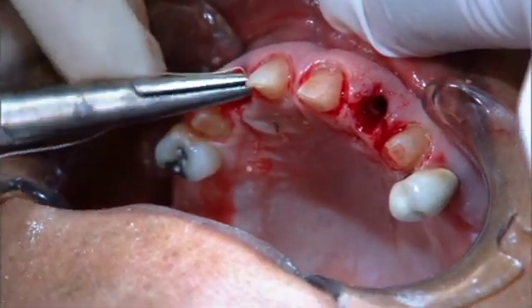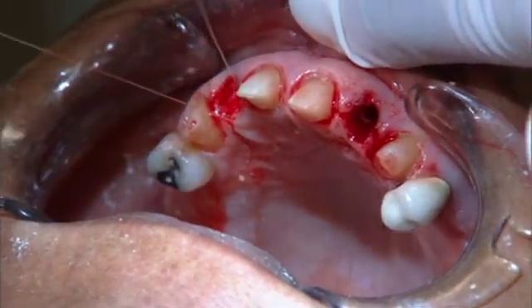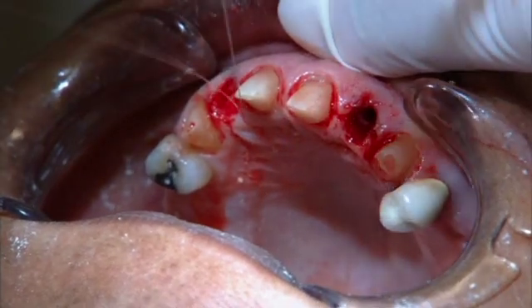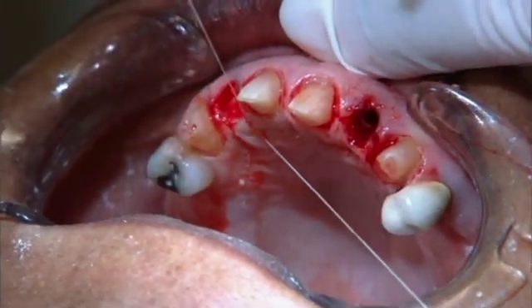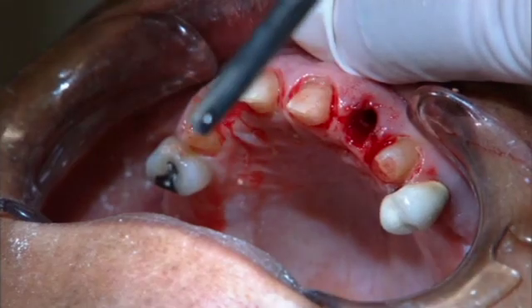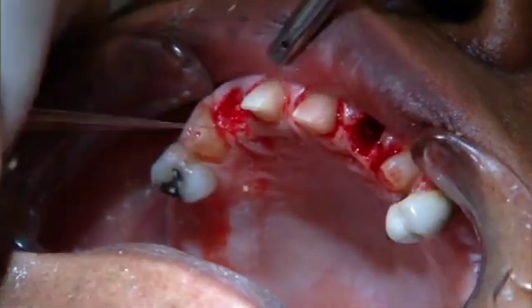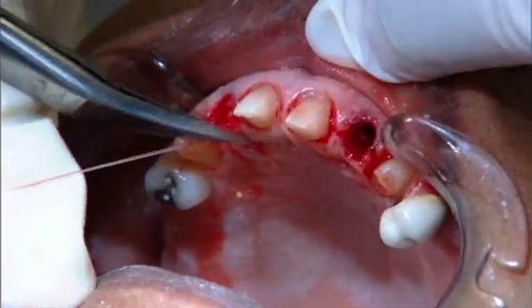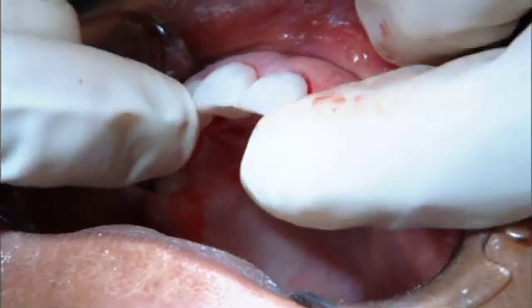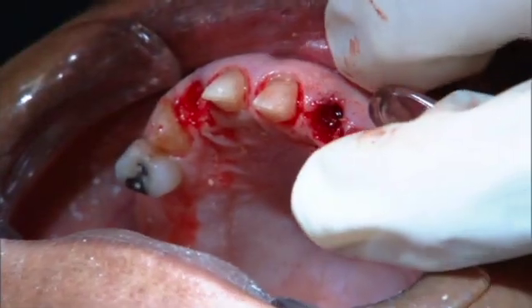This is going to support all the hard tissue, and the provisional is going to support the soft tissue. Then we'll use our provisional just to poke it back down and make sure that we got it where we want it. Now we'll just do the same thing on the other side.